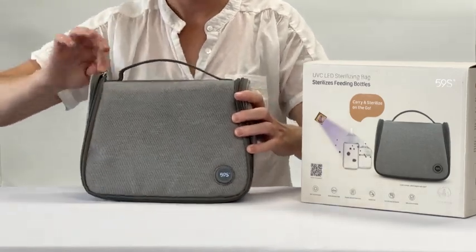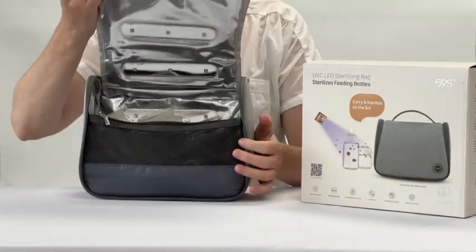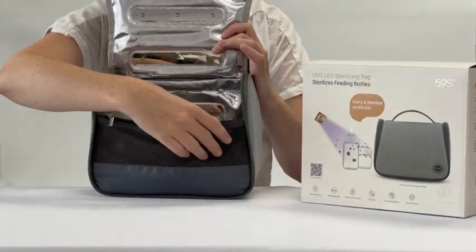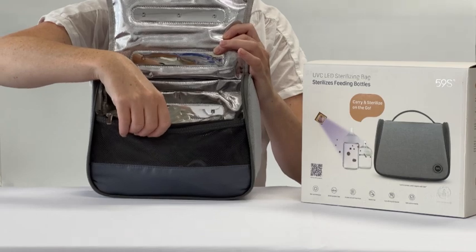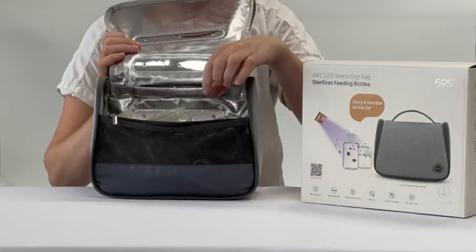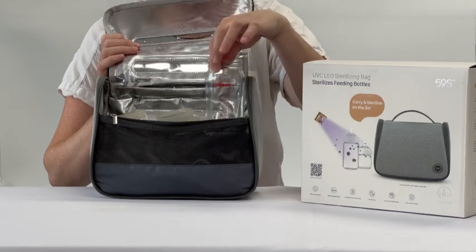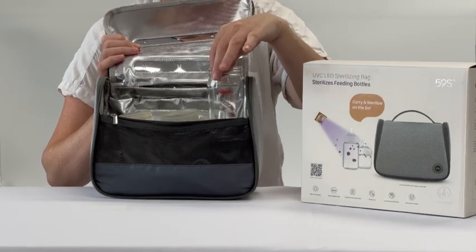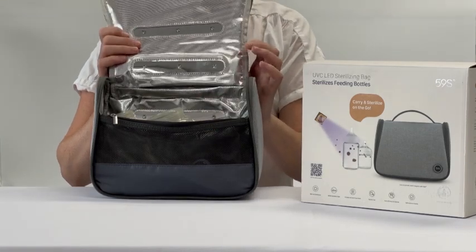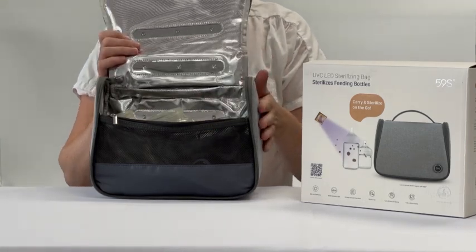To sterilize, simply place your bottles facing up along with any pacifiers in the front pouch inside the travel bag. It is still important that you wash your bottles with warm soapy water and rinse them before placing them in the bag. They can be placed in wet, however the bag will not dry the bottles.